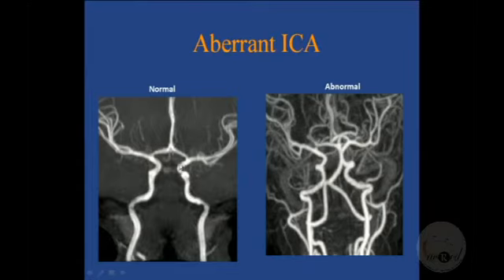Because many times this is what happens. If I really want to put the common things which are missed, you can put them into four boxes. One, when you're not suspecting a finding. If the clinician sends it as, I'm suspecting a stapedial artery, then you'll find it most of the time. Or if they say, at least I see a pulsatile red thing in the middle ear, you will either find a glomus, or you're looking for a glomus, or a persistent stapedial artery, or something like that.